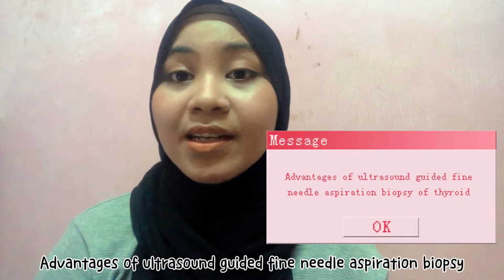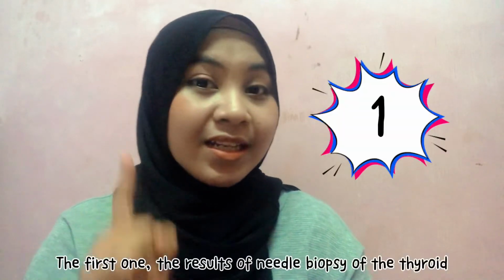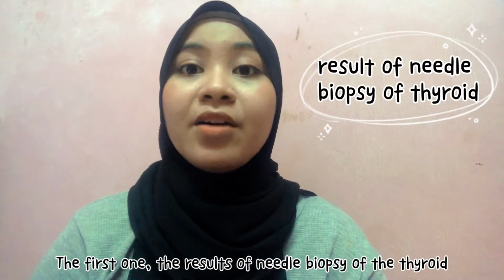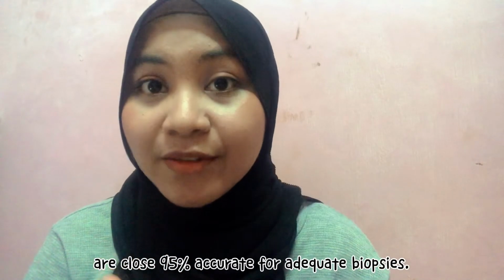Advantages of ultrasound-guided fine needle aspiration biopsy of the thyroid. The first one, the results of the needle biopsy of the thyroid are close to 95% accurate for an adequate biopsy.